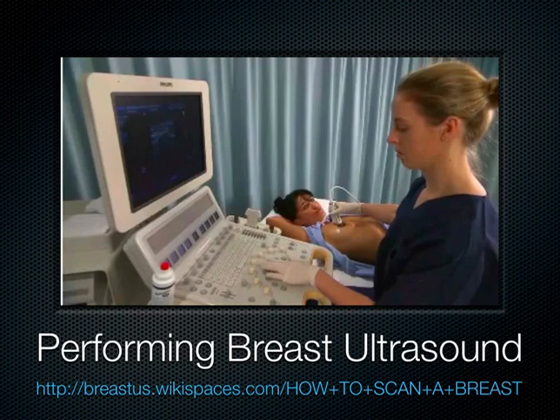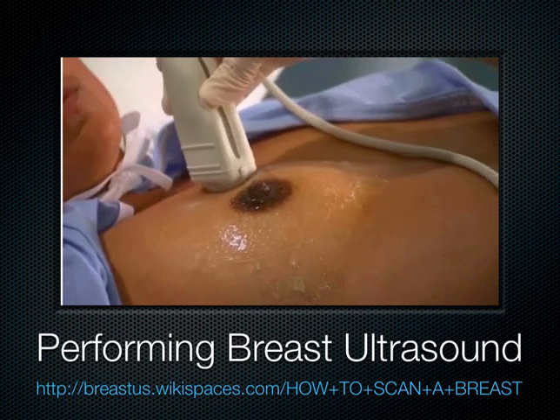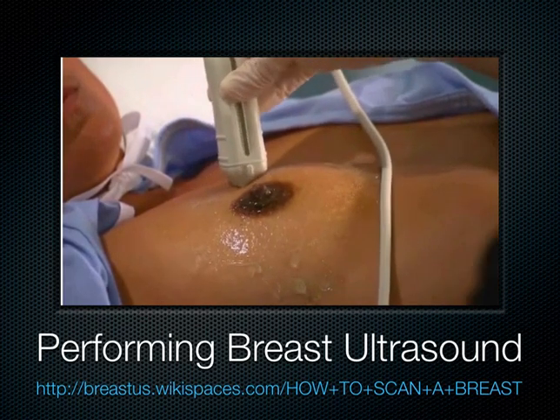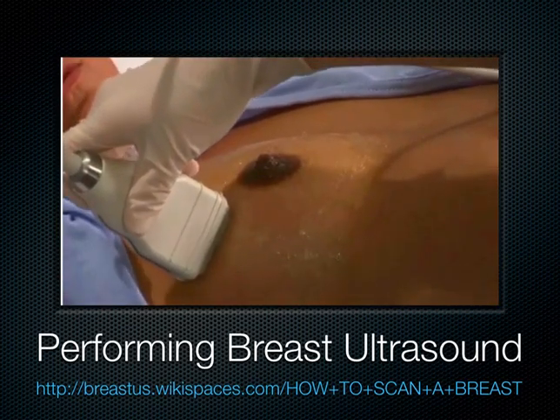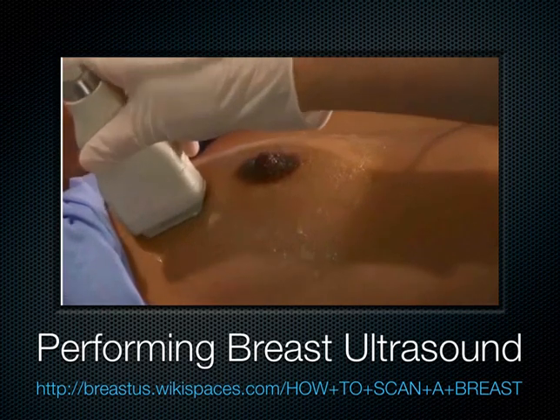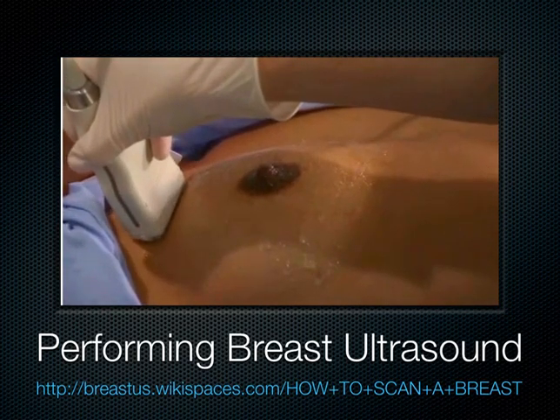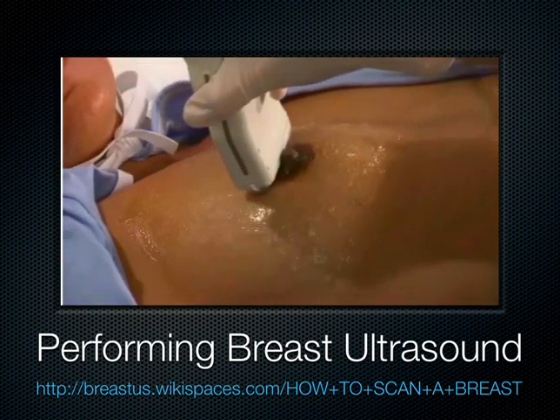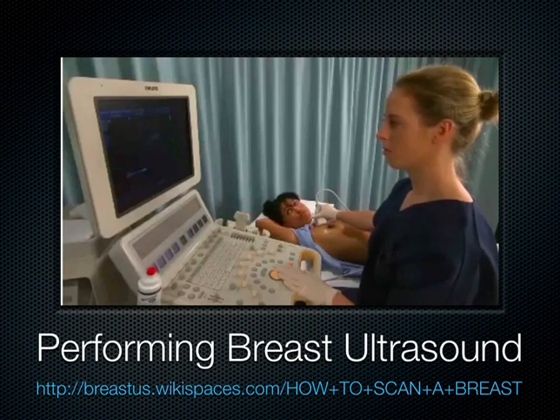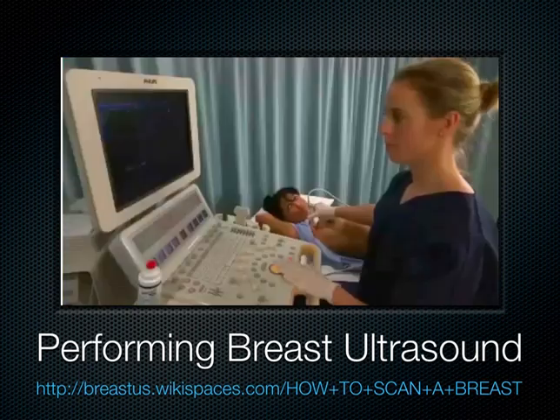If the entire breast has not been viewed completely during the first radial scan, a second radial scan may be required to image the outer zones of the breast. After completing the radial scan, return the transducer to the 12 o'clock position at the outer margin of the breast. Rotate the transducer to the anti-radial plane. Slide the transducer from the outer margin of the breast towards the nipple. Repeat this at each of the clock positions, moving in a clockwise direction.